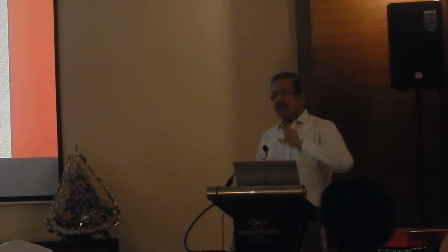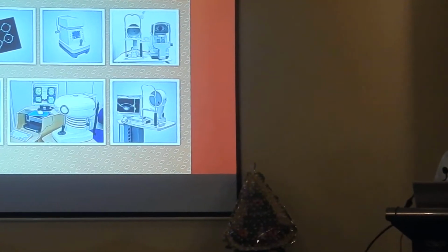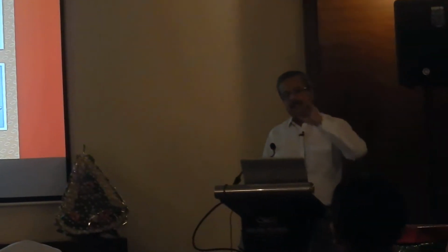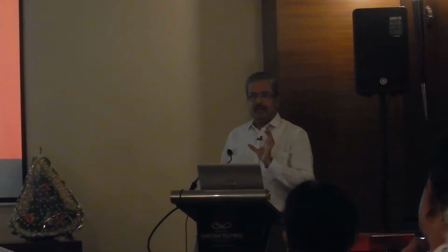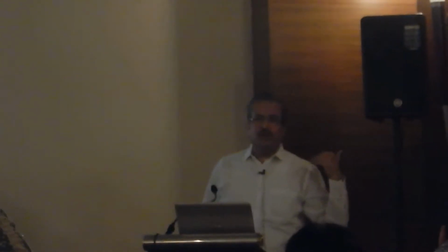Now, the manual keratometer, very briefly, tests your astigmatism at a 3 millimeter diameter from the center of your pupil. Now, this is achieved by a fluorescent light which is reflected like a convex mirror from your cornea. Every other instrument is basically dependent on this principle.